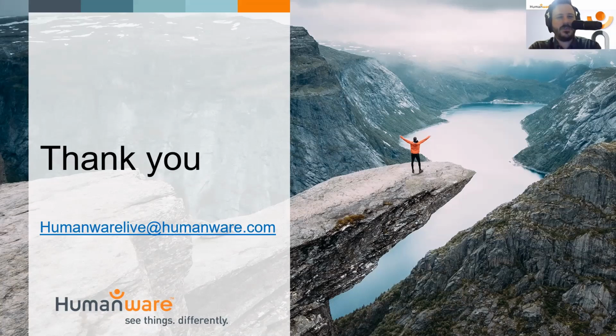The Mantis version will be coming soon, right, Andy? Yes, just waiting for your approval, Peter. Yeah, it's on me. I know. I think we're good to go on it. I have a few commands I wanted to add, but those documents are separate from the user guide because they're a lot longer, and they really do go into more detail on some of these basic commands.